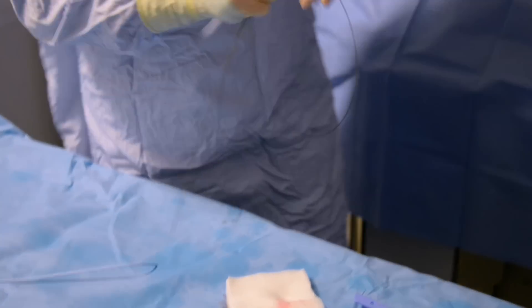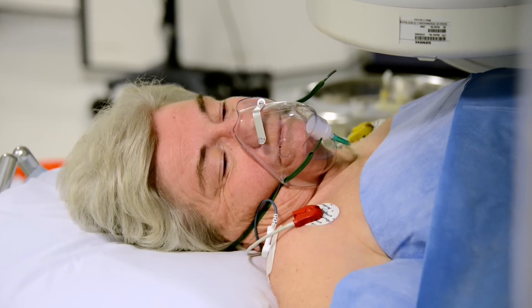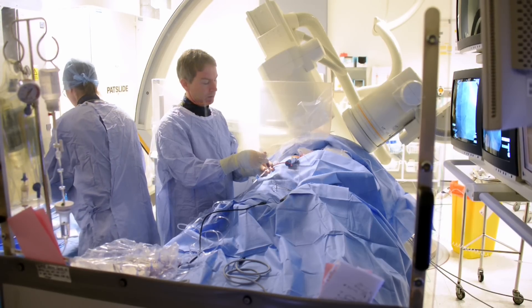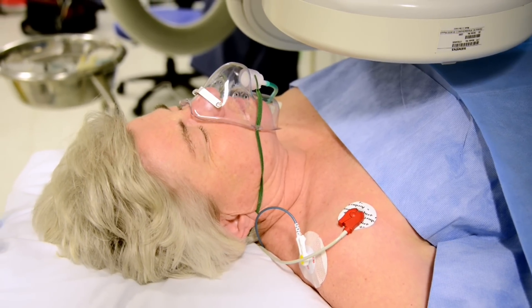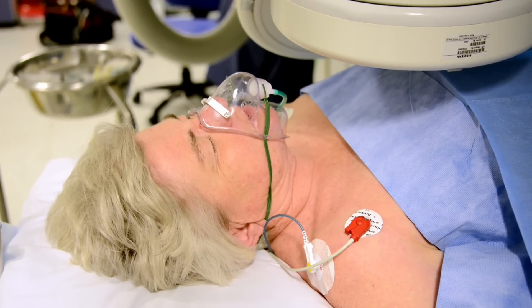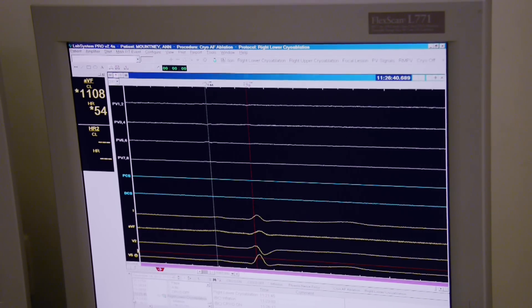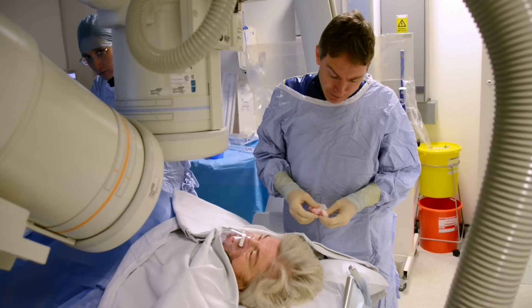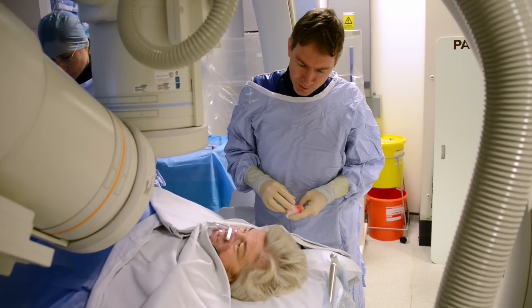Ablation with radiofrequency energy can be painful. It's not an excruciating pain — it's the sort of pain that almost anyone can just grit their teeth and put up with for the few minutes that it lasts. Perfect result. All of the veins are successfully treated. You've got a very good probability that will remove the episodes of atrial fibrillation.